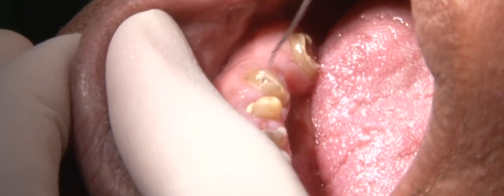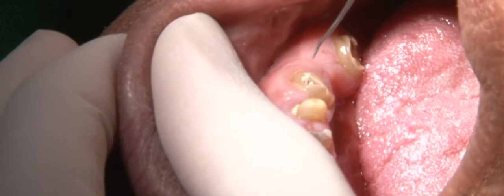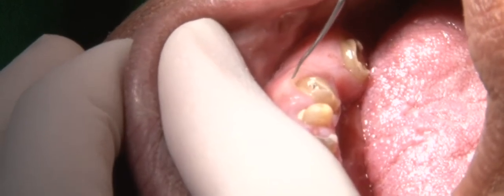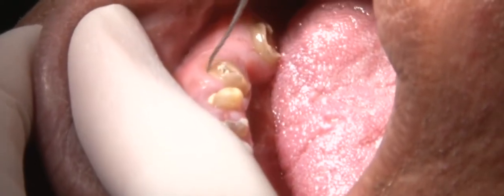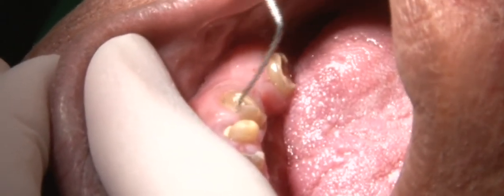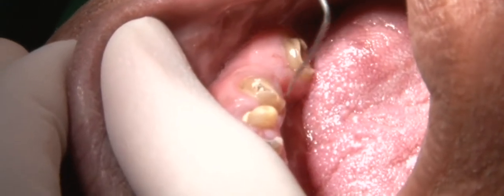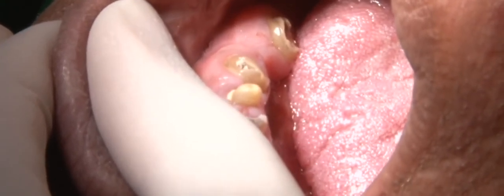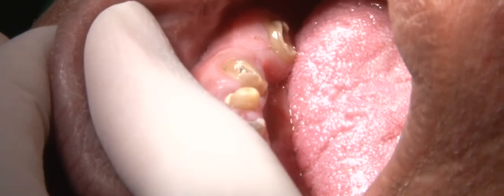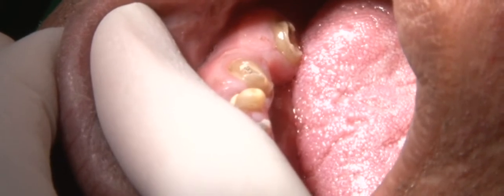On clinical examination of the tooth, one can see that sufficient amount of tooth structure is lost. In such cases, 1 to 2 millimeters of healthy tooth structure is required that can help in achieving the ferrule effect. In case there is any fracture below the gingival line, the success rate of post and core is reduced drastically. As you can see, there is sufficient tooth structure above the gingiva. So, we will proceed with the post space preparation.